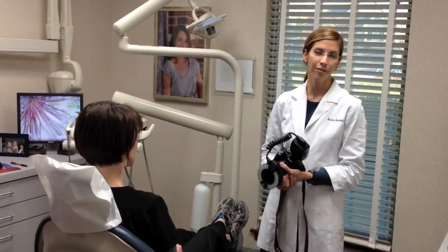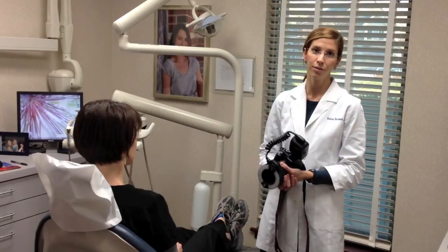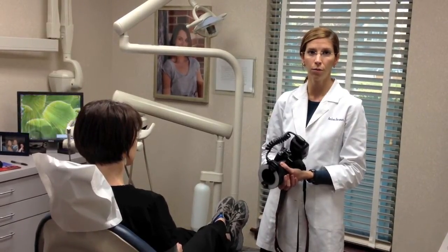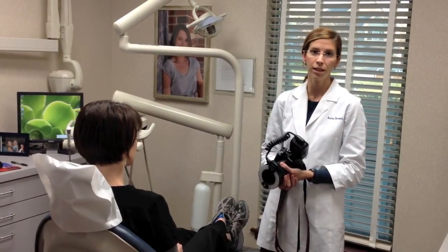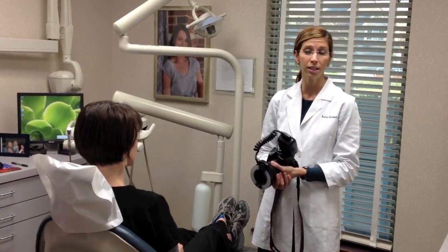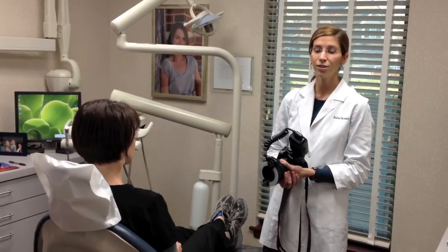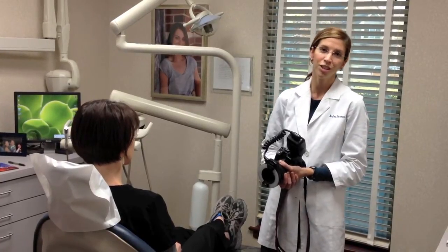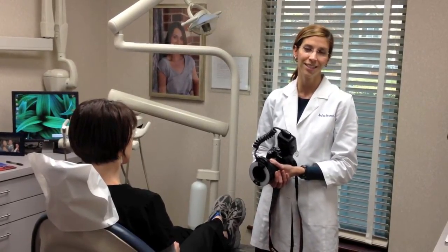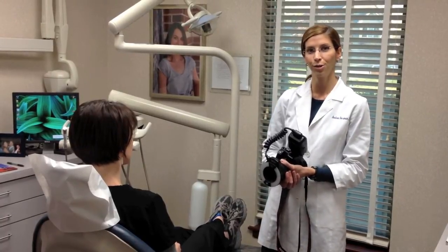I'm going to demonstrate the seven digital photos that I love to take on every patient in the practice. Especially having them on new patients is helpful for so many things, from helping the patient learn about their own teeth and the conditions in their mouth, to making decisions about treatment. I also use them to communicate with the lab and to share cases with other dentists. Let's take a look at the seven photos that I use most commonly.